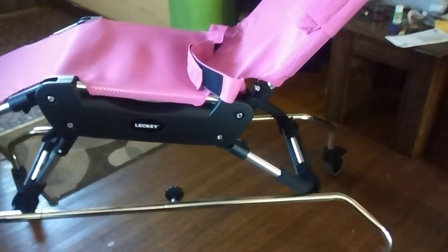Each caster wheel has its own locking mechanism right on the wheel there. Just push it down on all four casters whenever she's being transferred. Kick it back up when you're ready to move.